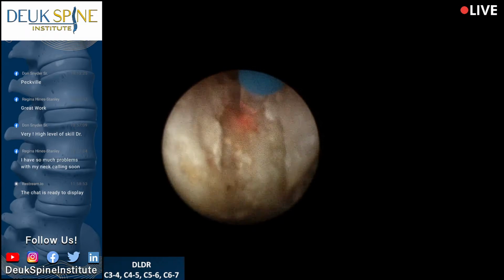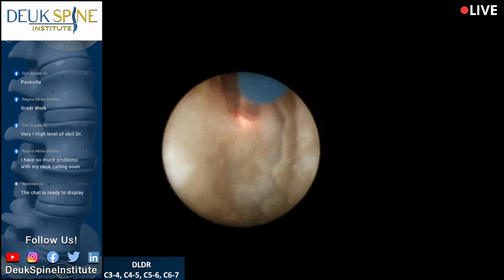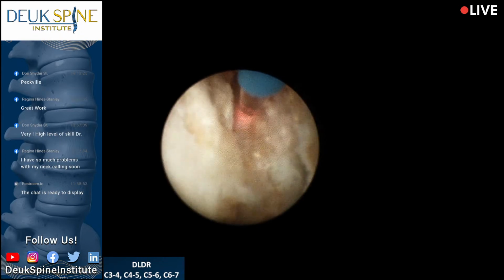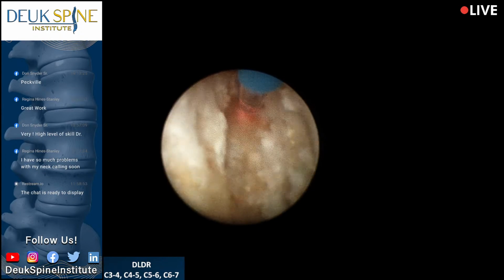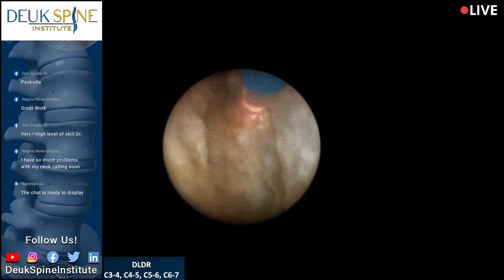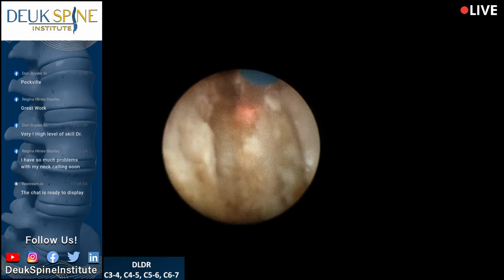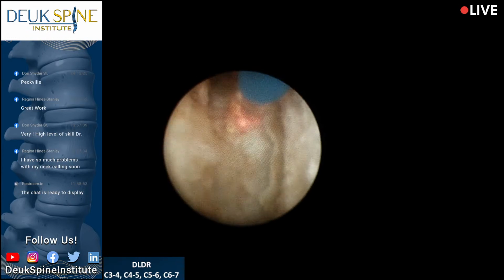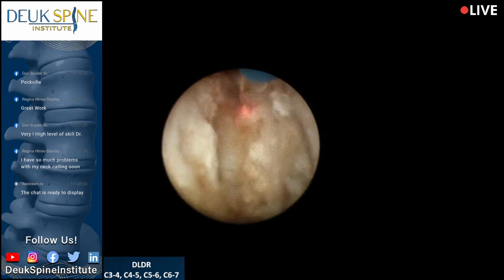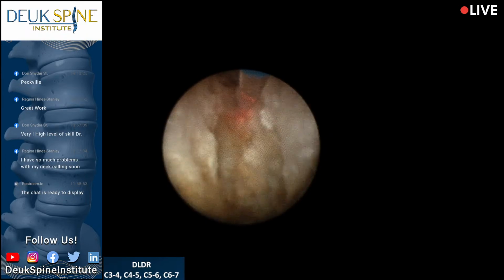That's posterior ligament right there. Posterior longitudinal ligament, a little bit of scar tissue here. But you see how the fibers run up and down, which is left to right for you guys? That's PLL. This is where the herniation was. I've cleaned it all out. I've shelled it out. There's just a little bit of scar tissue left here. And then we're done over here. So this patient doesn't have anything behind the PLL.